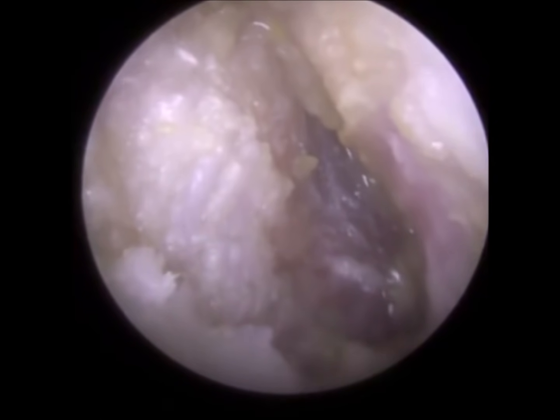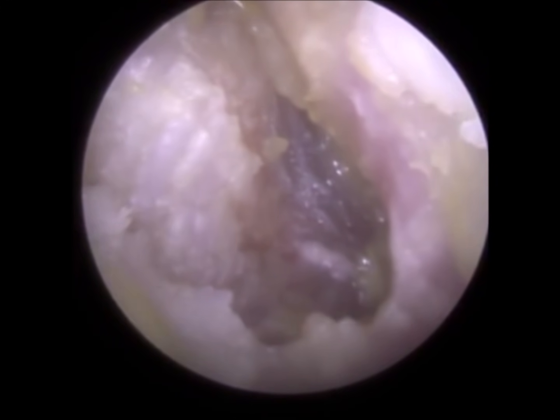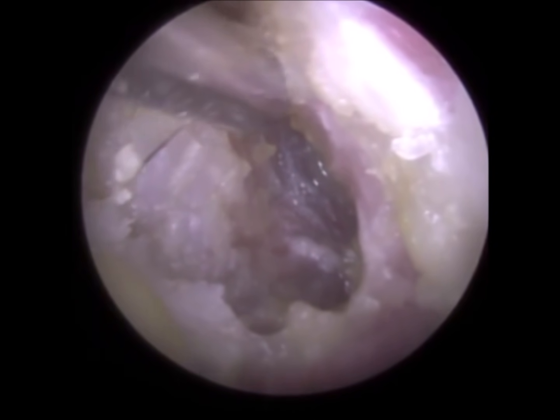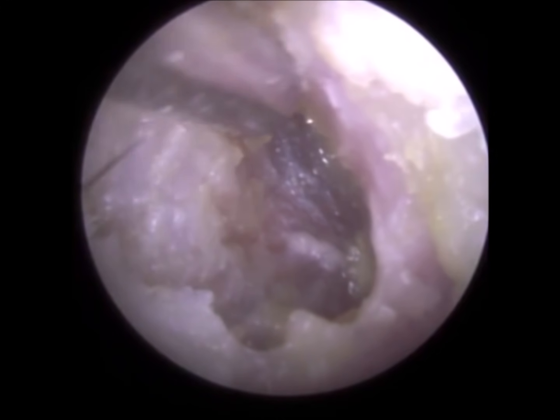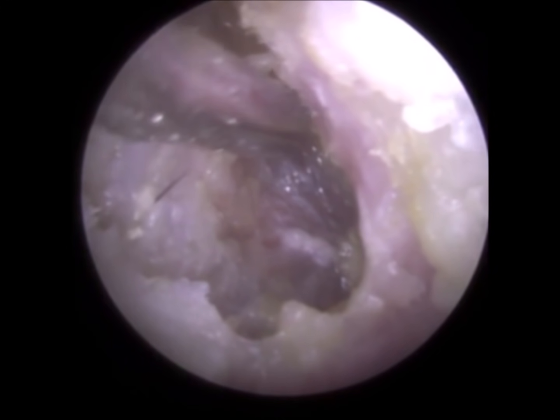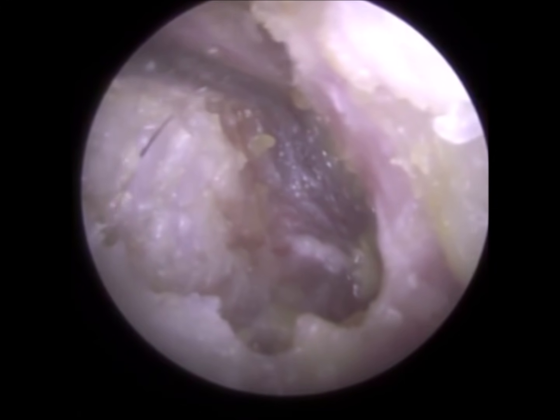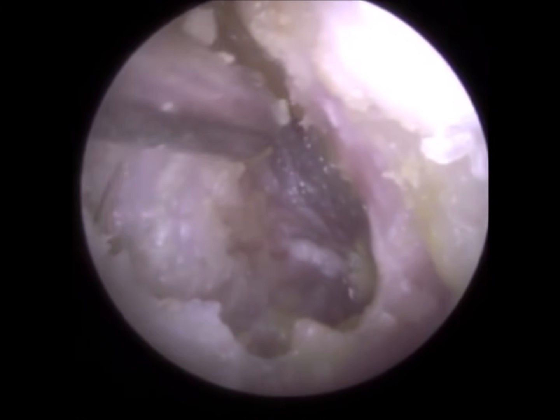So at this stage, the patient's symptoms were alleviated. He could hear, and I can just about see the eardrum there. Obviously, there's a lot of dead keratin. He's had this infection for a long time. That will now have to naturally shed. I can see the hammer bone, the handle of malleus. And again, I'm just trying to mop up a bit of discharging keratin from his anterior recess, and to get access we've had to bend this fine end gauge suction probe to even get access to that part of his ear.